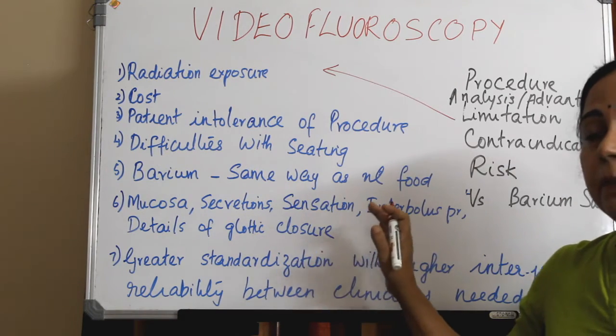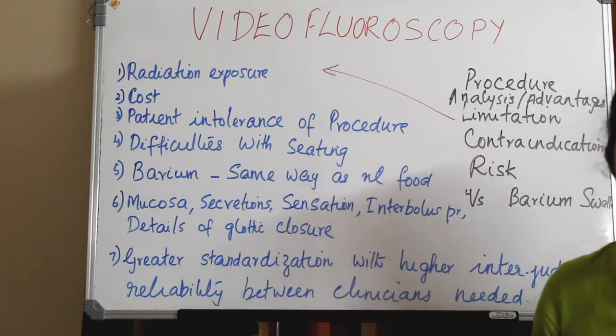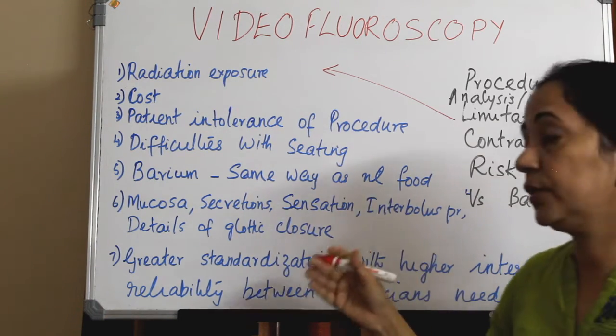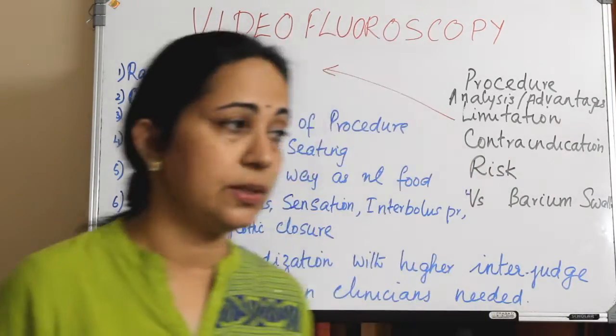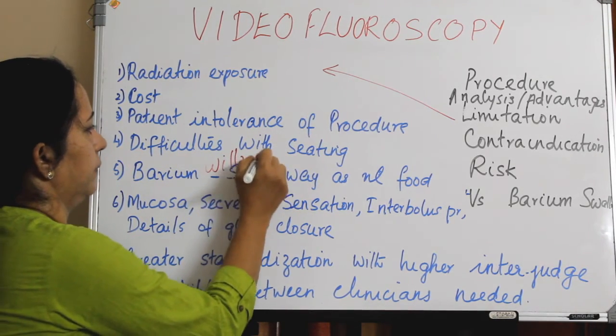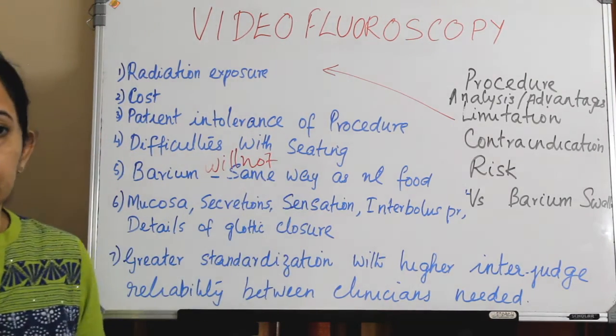And you are giving barium-coated food to coat the structures, so sometimes it will not behave the same way as normal food and liquid.